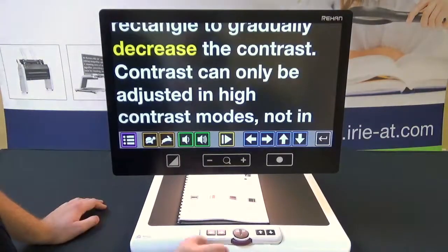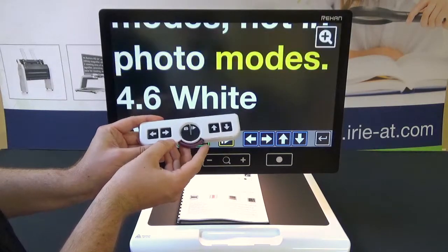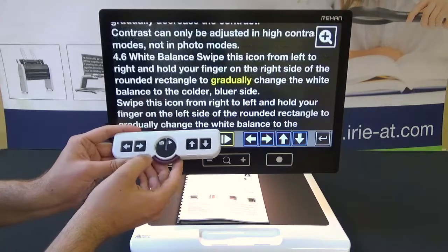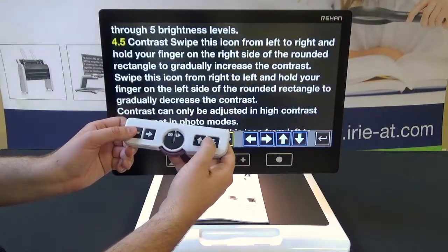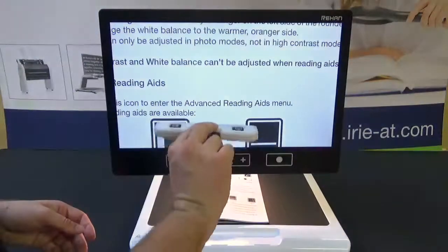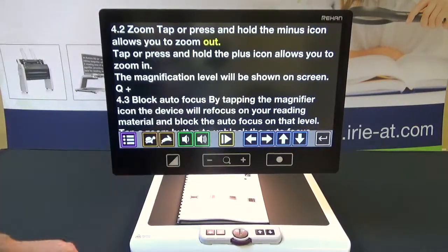Going back to the document menu just to show you the remote working in OCR mode: I can zoom in and out, navigate word by word or by paragraph, and play and pause. I can also trigger a new OCR capture from the remote. Then if I flip the remote back over it switches to magnifier mode, flip it back over again and it left off right where I was, and I can start reading again right away. And that does it for the Acuity Speech.